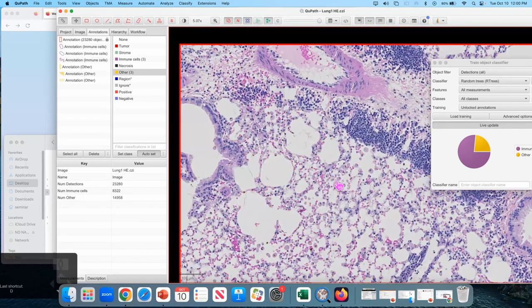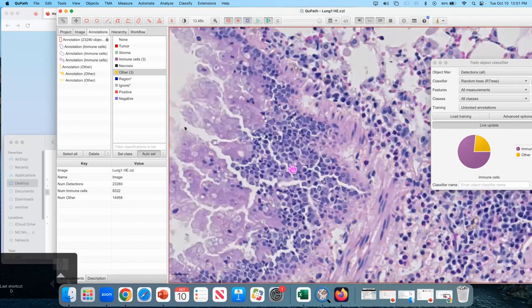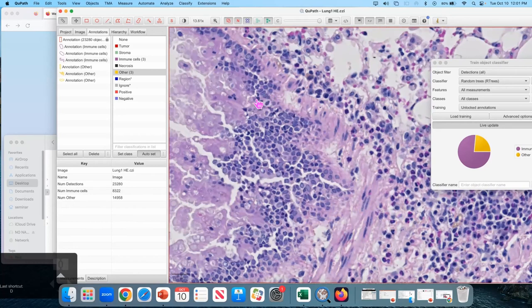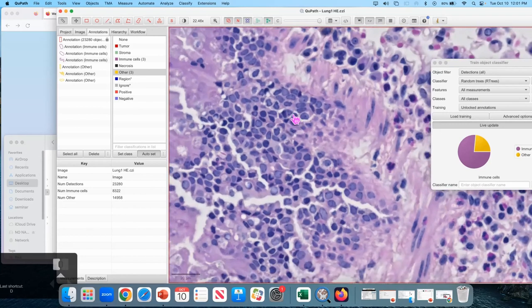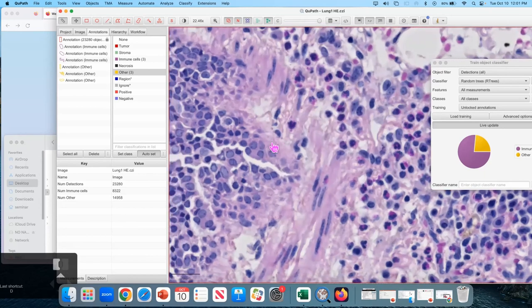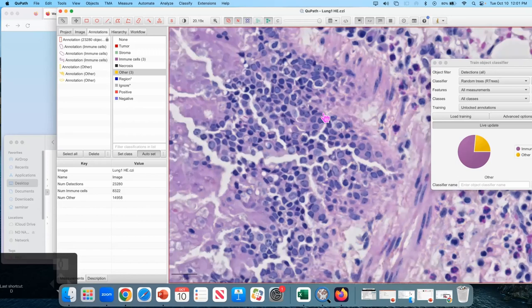I heard someone ask what's going to be the next thing. These are bronchial epithelia. They are not immune cells, but they're going to come up as purple because they're dense. They've got a lot of nuclei. They're compressed. Honestly, when I was prepping this, I had to go to Ken and ask, "These aren't immune cells, right?" Because I wasn't completely sure. So if at this stage you're lost, ignore the epithelium, it's fine.